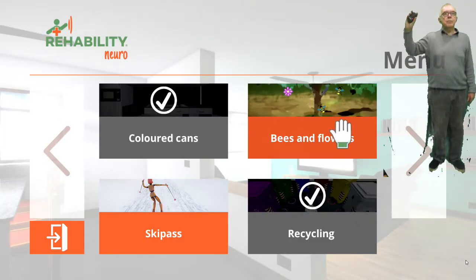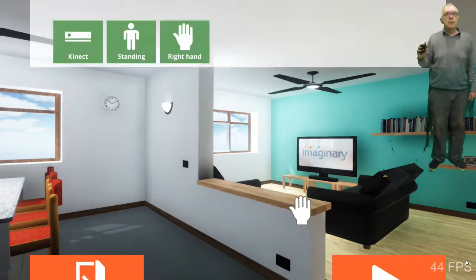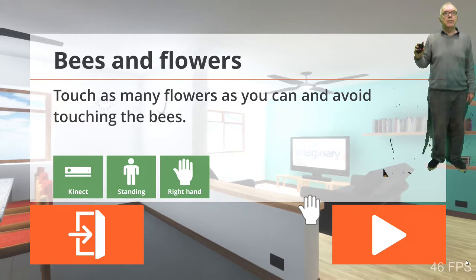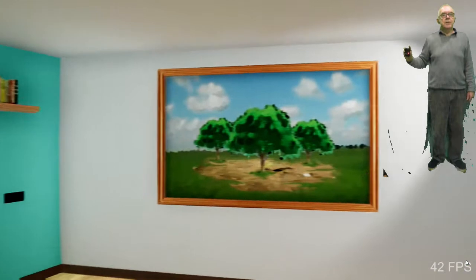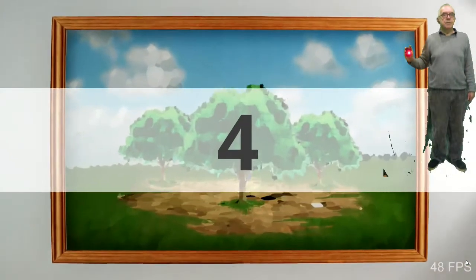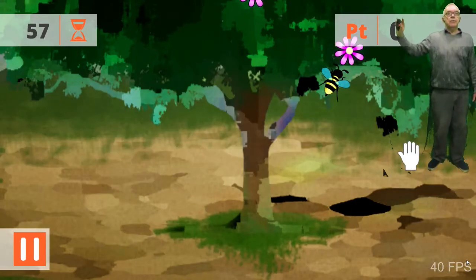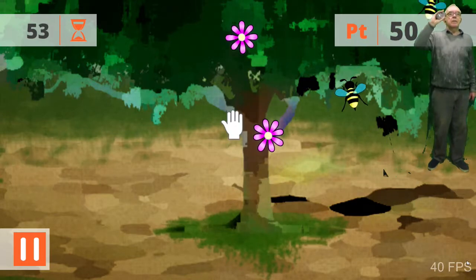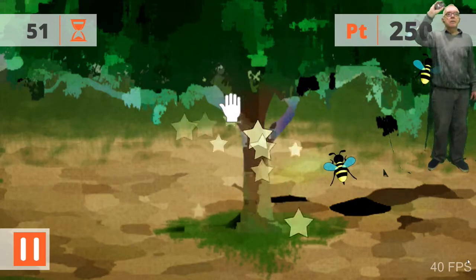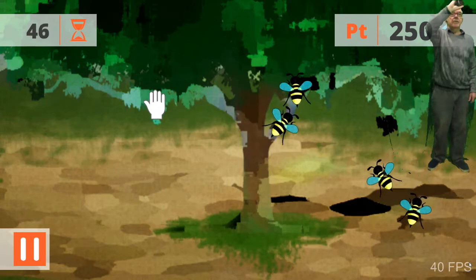So I'm now going to choose bees and flowers. And on this one I've got to avoid the bees and touch the flowers. So I set it up so the distractors, the bees that you've got to avoid, represent 50% of the elements that come down the screen. So I've got to avoid bees. Oh, I've got one there. Flower, flower. Keep away from the bees.